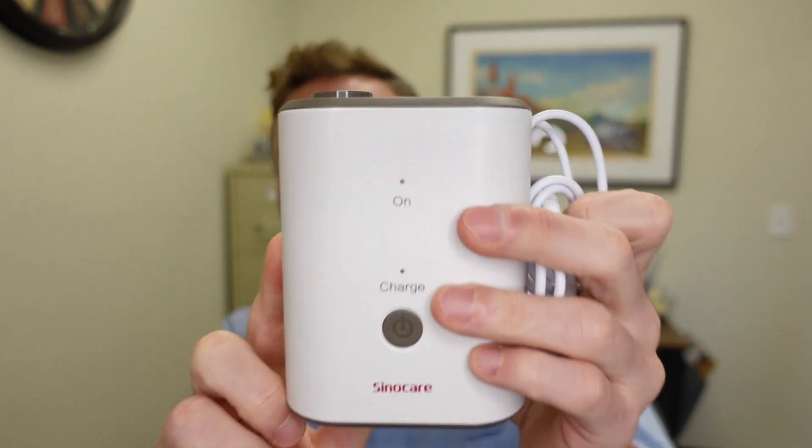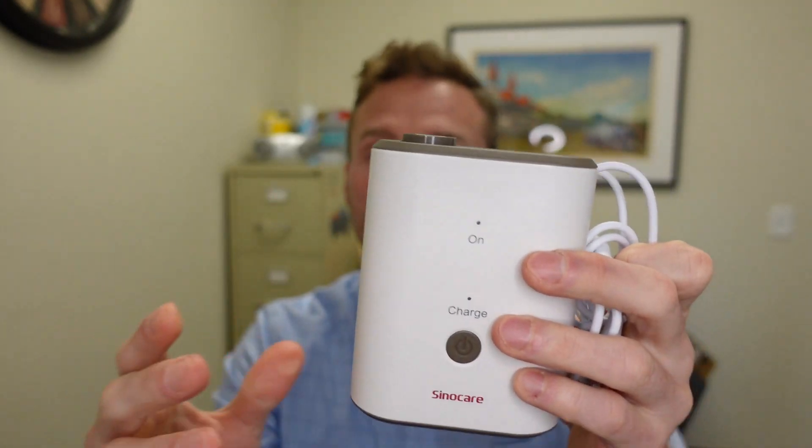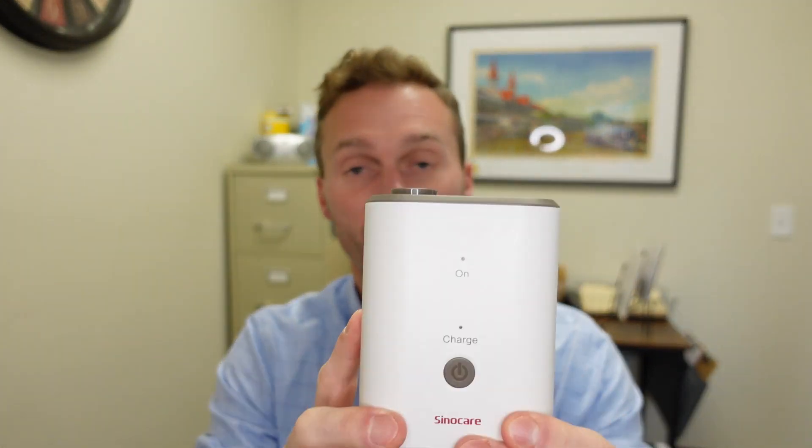It also comes with a USB cable, which makes this perfect for somebody that has to travel with their CPAP — for instance, an over-the-road driver. This is very small and portable. You can plug this right into your USB outlet in your truck or your car and disinfect your CPAP machine. And it also comes with a little travel case, since it's meant for travel.